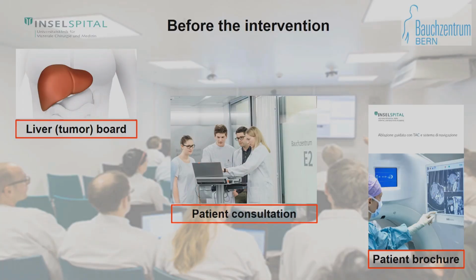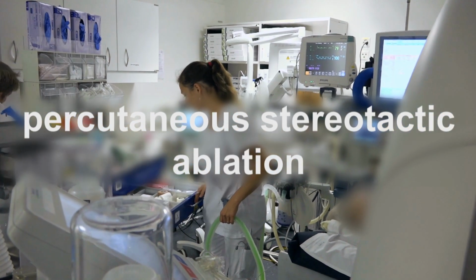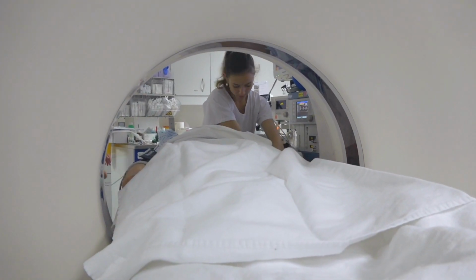Before any intervention, the patient is discussed at our liver tumor board, seen in the outpatient clinic, and informed with the help of a patient brochure about the planned intervention. Percutaneous stereotactic interventions generally take place in the interventional CT suite, where the anesthesia team preps the patient for the general anesthesia with jet ventilation.